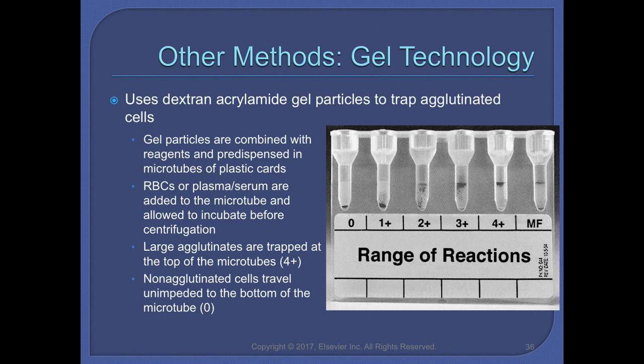However, with tube testing, there's a little bit more subjectivity involved, so it could always be better to have a method that is more stable across the broad spectrum.